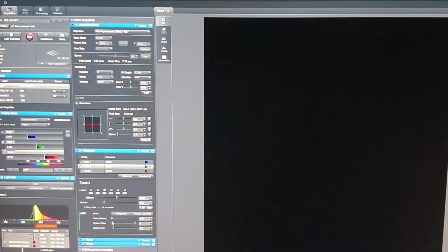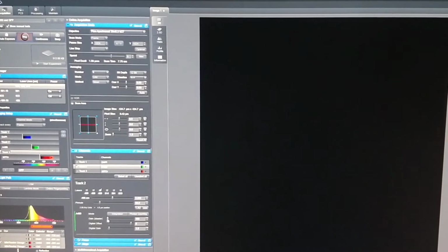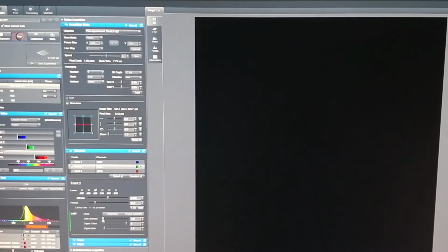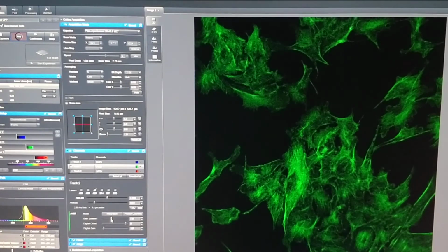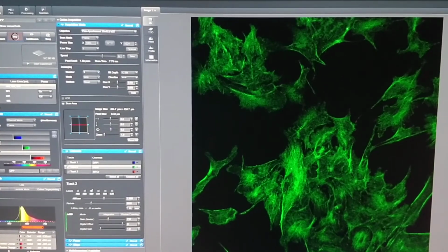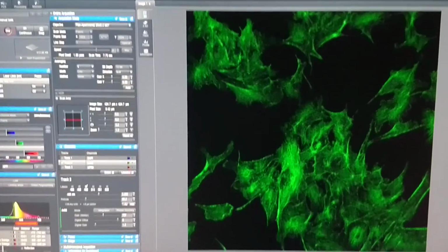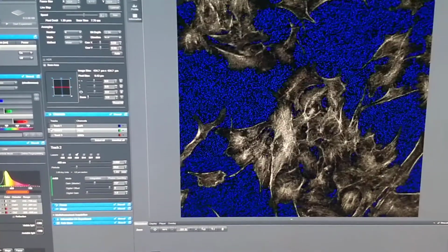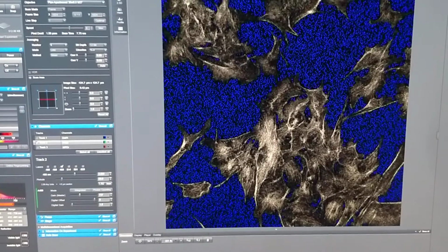Okay, so here we don't see anything. Don't panic yet, because my gain master is at 166 or say 188, so it's too low, so I'm going to increase here. Okay, and you're going to see the image here again. Okay, so the same thing, we're going to click on the rectangular image here, and I'm going to see here.